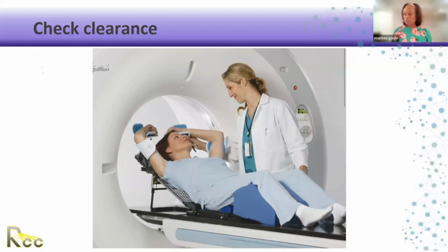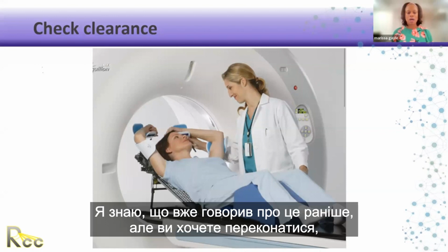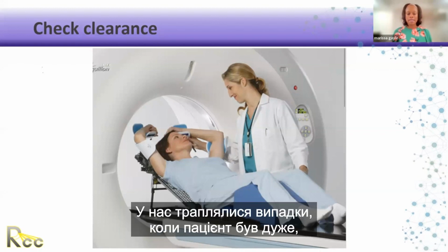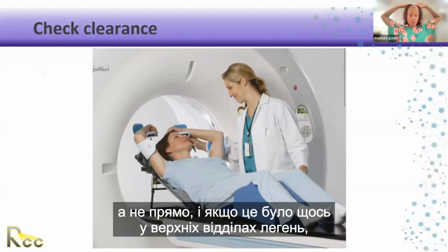Okay. So the next slide is clearance. I know I spoke to it before, but you want to make sure that once you create this immobilization device, it will clear the machine. We've had it on occasion where a patient is really tall and their arms go out very wide instead of straight back.